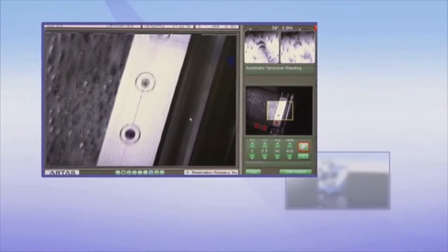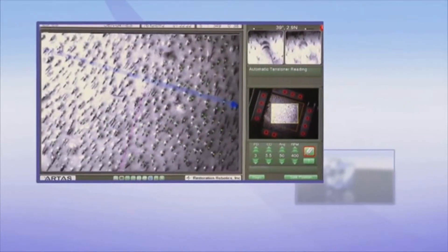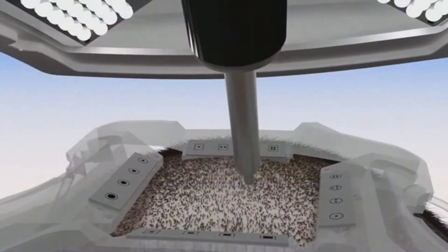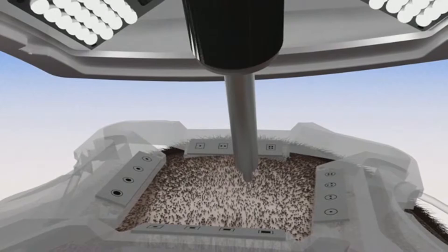Your doctor will then position the robotic arm to start the procedure. The ARTAS System will then methodically identify each follicular unit at its optimal approach to harvest healthy grafts for better regrowth after transplantation. Your doctor will use their artistic ability to design the best hairline for natural and permanent results.